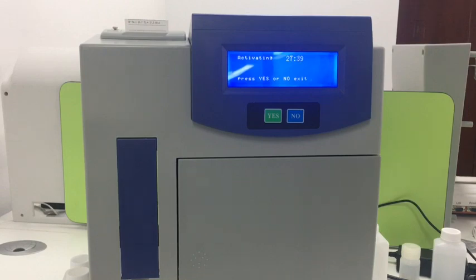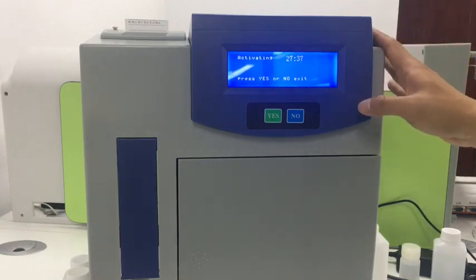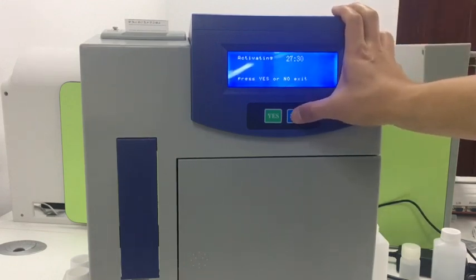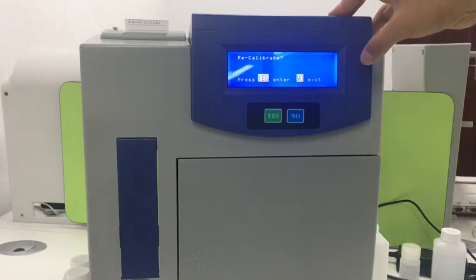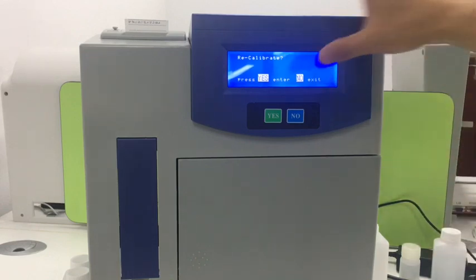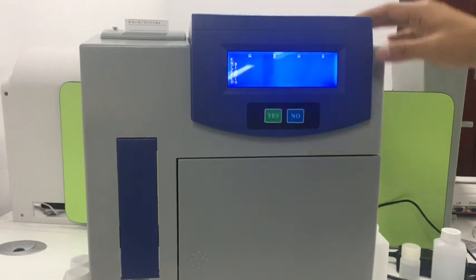So if you don't need to activate, press No to exit. Then we go to the recalibrate menu page. You have to do the calibration before running the machine, so we press Yes.